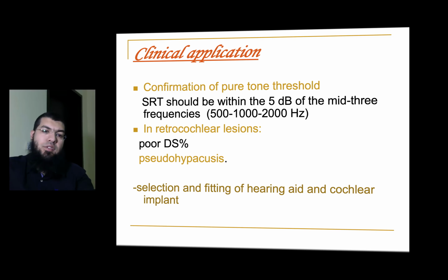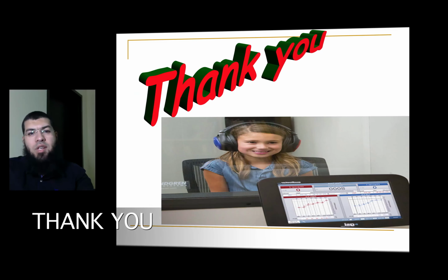It is used in pseudohypoacusis or malingering hearing loss, and finally it is used in hearing aid fitting, hearing aid selection, and in cochlear implantation.